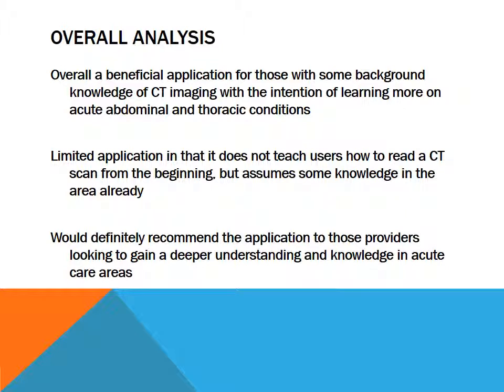Overall, this application is most beneficial for those with some background knowledge and understanding of CT imaging studies who would like to become better at reading them and understanding acute abdominal and thoracic conditions. The application is simple to use and therefore is limited in that it does not teach users how to read a CT scan from the beginning, but instead assumes the user has some knowledge in the area already. Any provider looking to gain a better understanding in acute care areas of these conditions can benefit from this application.